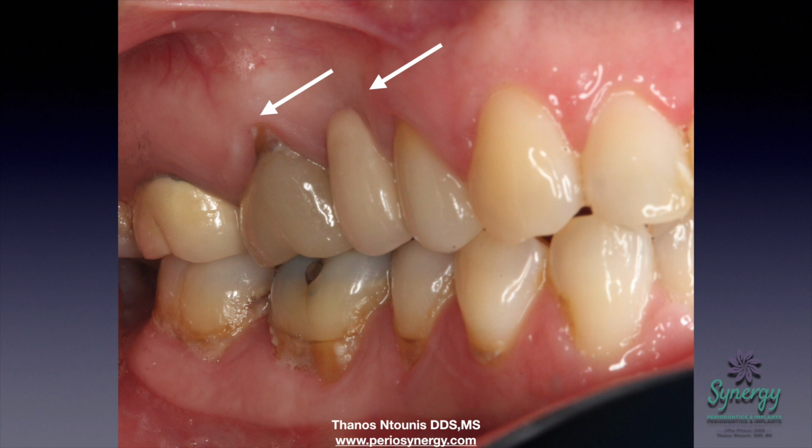There are restorative designs, such as the adjacent crown on the molar, that are not biologically friendly. You see the crown margin extending into the bifurcation. And there is also recession associated with the adjacent teeth. So the upper right is an area where there is recession, thin gingiva around the teeth, thin peri-implant tissue around that implant, and a minimal zone of attached tissue and thickness of tissue on that implant.